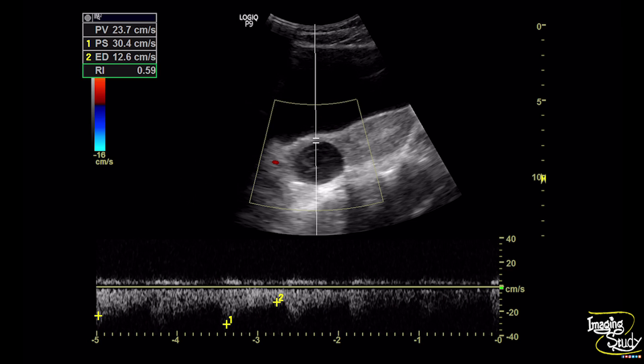With color Doppler, we found no vascularity within the lesion. The most adjacent vessel to the lesion shows a moderate resistant flow pattern arising from the ovarian artery. The resistive index is 0.59, which essentially excludes ectopic pregnancy — a common differential diagnosis. Even though this patient is unmarried, we should exclude ectopic pregnancy in any adnexal cystic lesion.